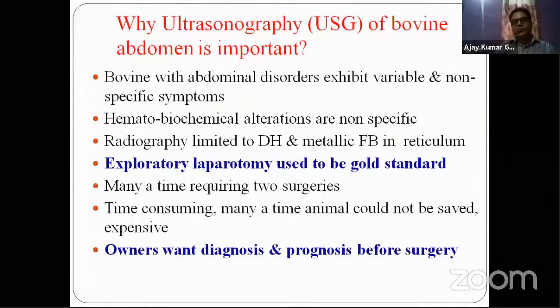Before I discuss ultrasonography of bovine abdomen, it is very important to tell you that to understand this lecture, you must have basic knowledge of ultrasonography. I hope that yesterday all of you attended the lecture delivered by Dr. Pankaj Gupta on basic ultrasonography.